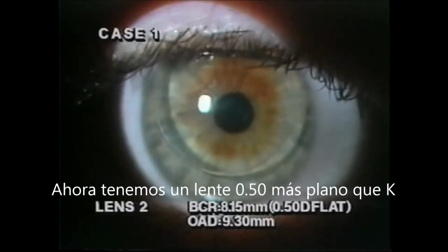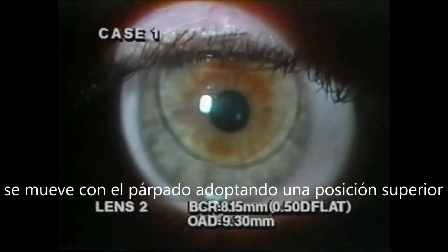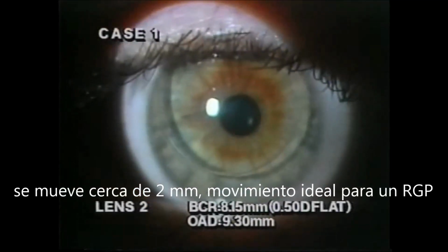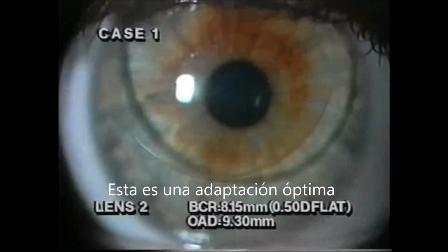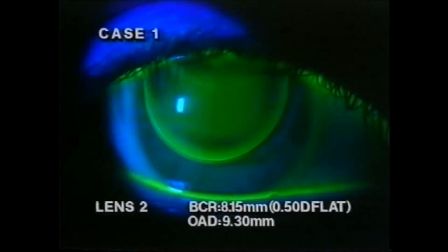Now, fitting a half diopter flatter than K, the lens is picked up with the blink and drops to a slightly superior, though well-centered position. Lens lag is about 2 millimeters, an ideal amount for an RGP. This is an optimal fit and representative of a slightly flat base curve on a myopic patient.